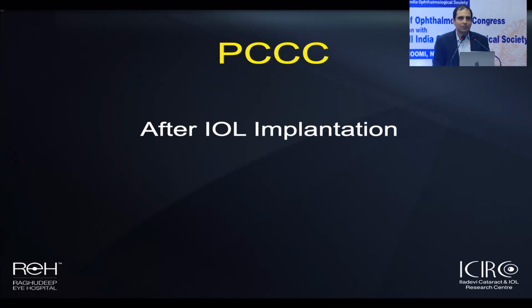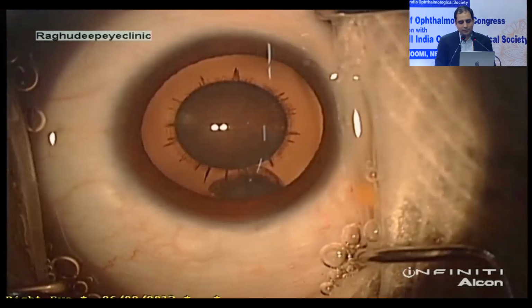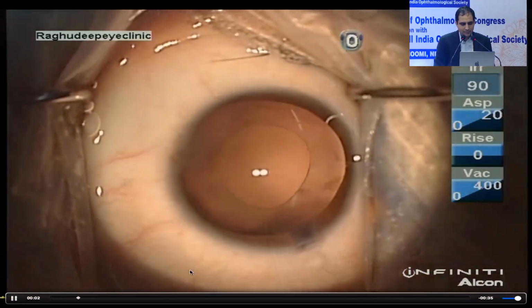Now there are options of doing the posterior capsulorhexis after IOL implantation, like Dr. Jethani had shown, and the easiest way is to do a capsulectomy with a vitrector. So this is the case that we start off with.